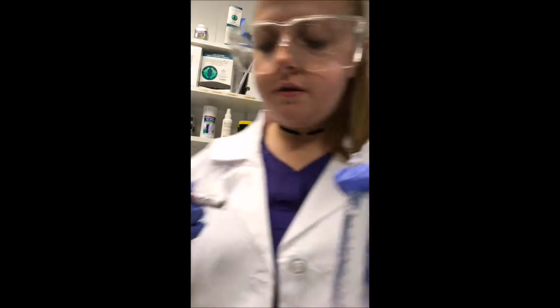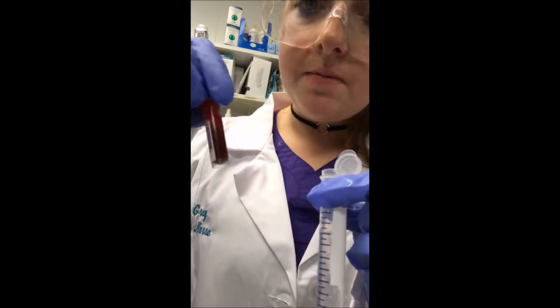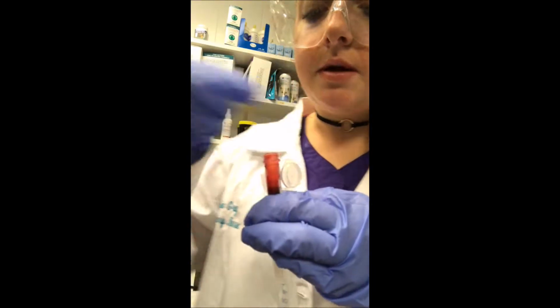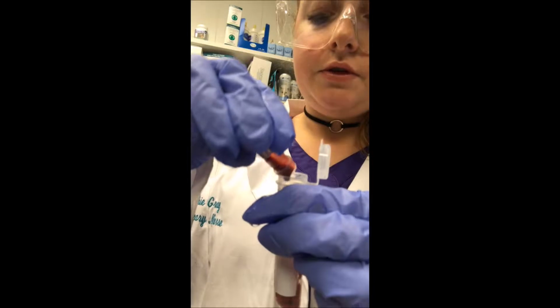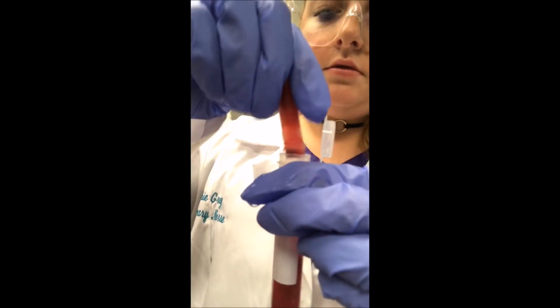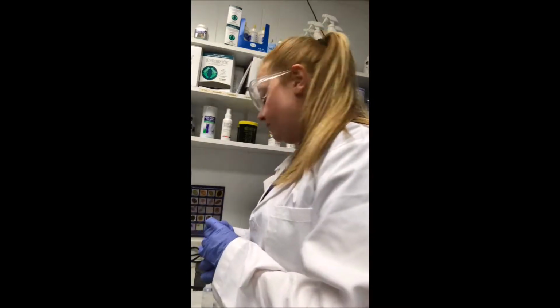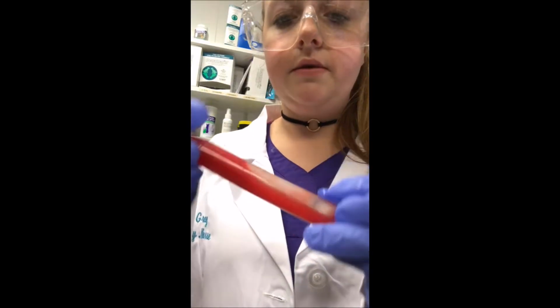Okay, and then this is from our Pound Dog. It's exactly 1 ml of blood. It's in an EDTA tube, so I'm just going to pour what I have in here into the tube with the formalin. We're going to invert it several times, just kind of mix it with the formalin.